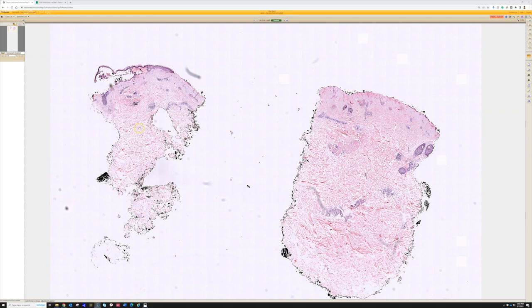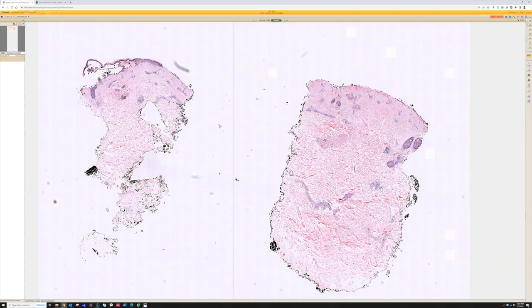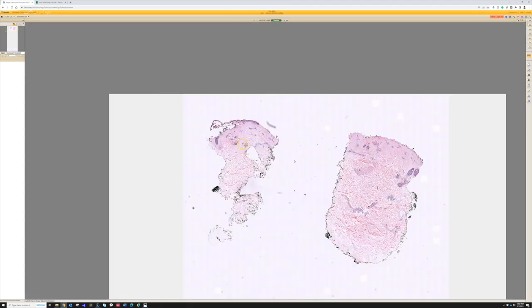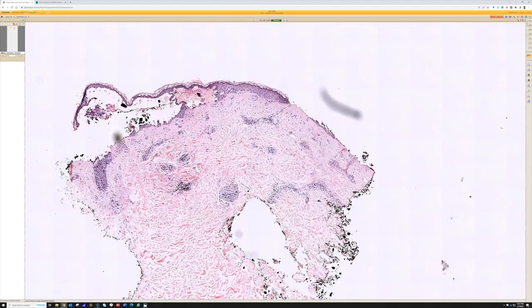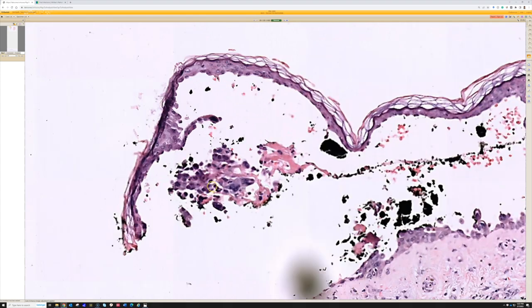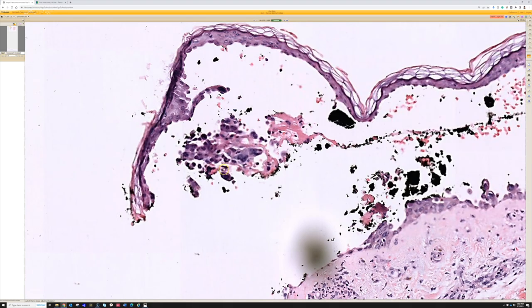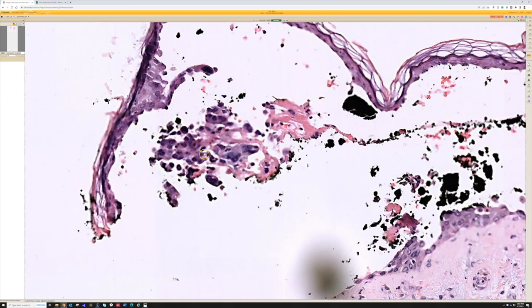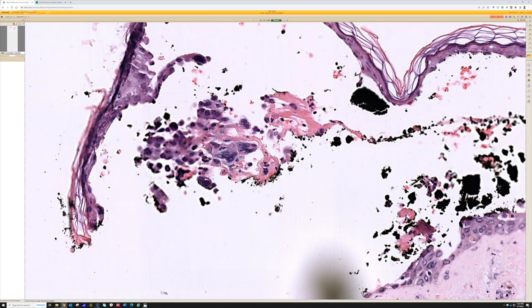This is case one. Here we've got a punch biopsy that's been bisected, and the left side looks different than the right. Let's go down and look at the left side, which is where the classic findings are. We've got a blister — an intraepidermal blister. There's some basal layer keratinocytes retained down here on the floor of the blister, and the roof has separated. In the blister cavity, there are free-floating keratinocytes that have detached from one another. That's acantholysis.